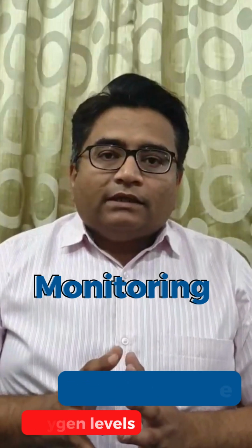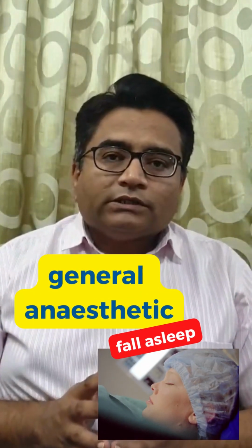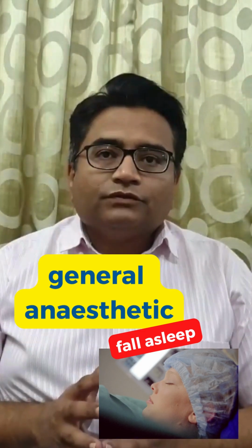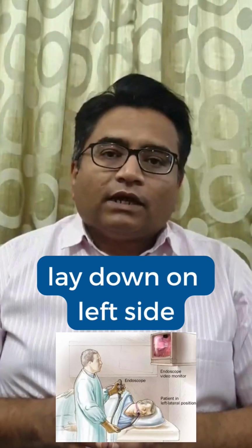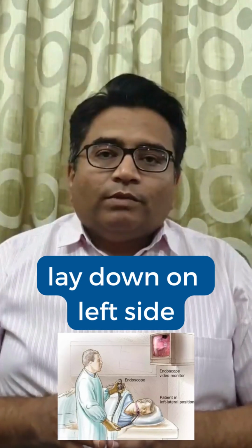You will be given either a short general anesthetic which will make you fall asleep for a small period of time, say 5 to 10 minutes, or there will be a spray to numb your throat so that you don't experience anything when the procedure is being performed. You will be asked to lie down on your left side, and if there are any ill-fitting dentures, they should be removed.